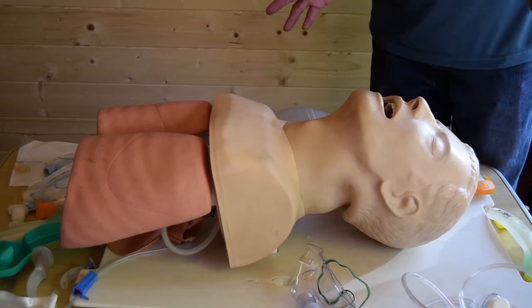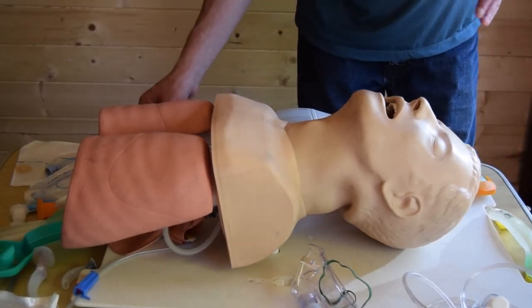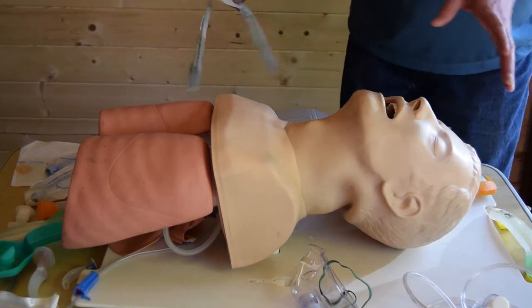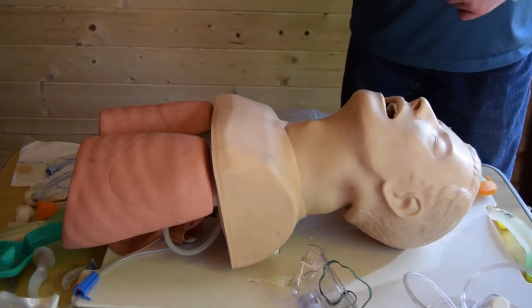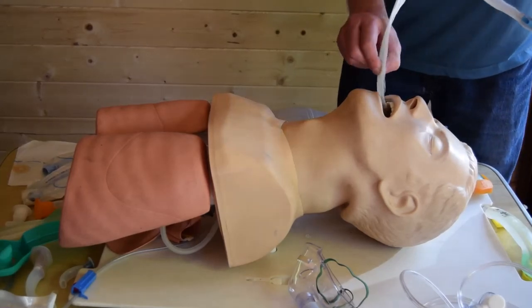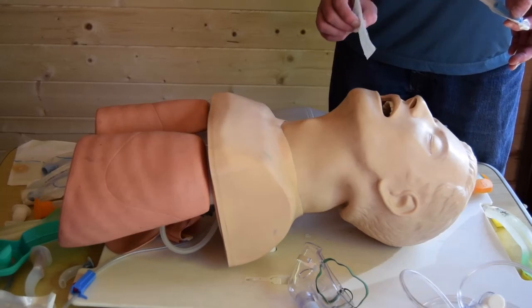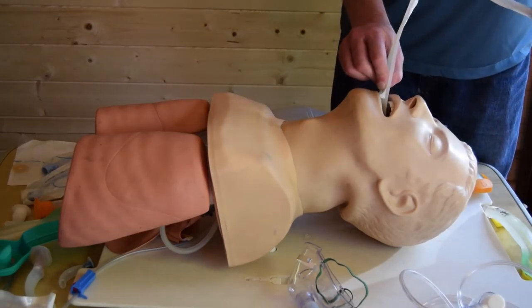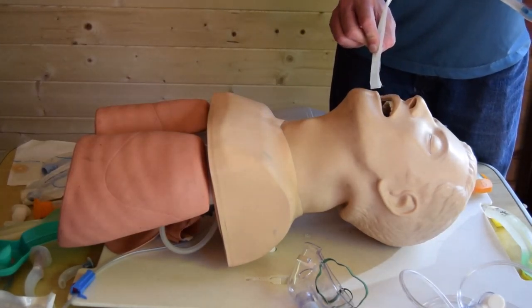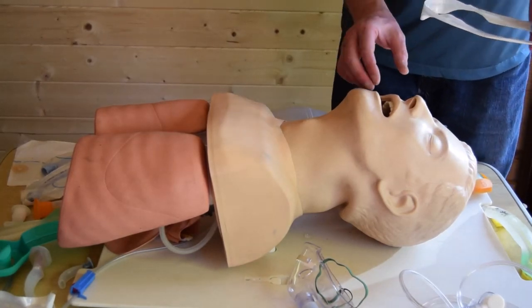The only other thing we have to consider is suction, and if a patient has some sort of foreign matter in their airway, such as fluid or vomit, we might use something like a Yankauer suction to suction the airway out. We would not suction for more than 10 seconds, and we always apply suction as we're pulling the suction catheter out of the mouth in order to not cause any vagus stimulation.